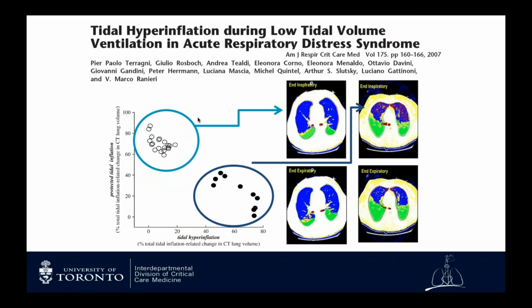Now, there are some patients, those with particularly severe disease, where even that may not stop all of the ventilator-induced lung injury. Patients, that you can see here on the right-hand panel, with the smallest baby lungs, when they go from expiration to inspiration, you're still seeing a lot of red showing up there, which in this graph is indicative of overdistension, despite using 6 mils per kilogram.